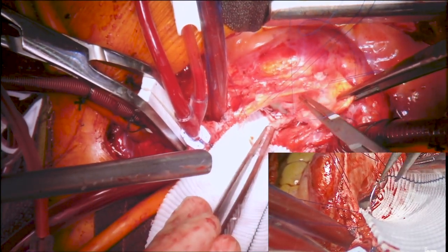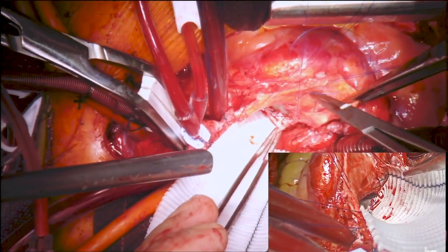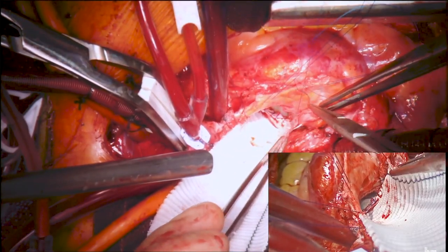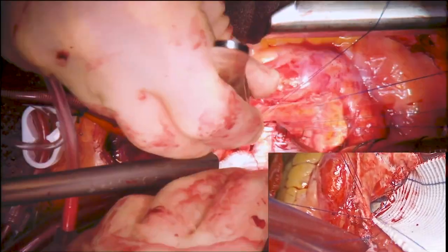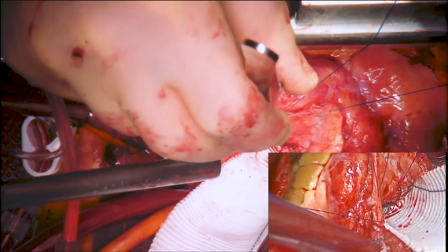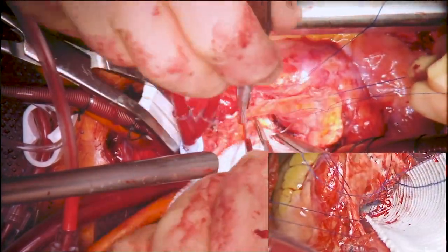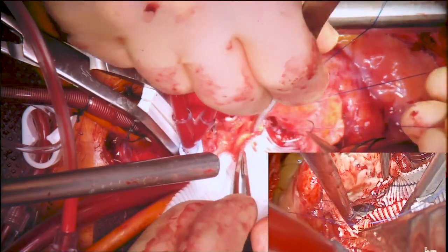The suture line was then run all the way up to the edge of the aortotomy on both sides, and then all the way up to the center of the aorta. Careful attention to stretching the graft is required here to minimize any bleeding afterward.